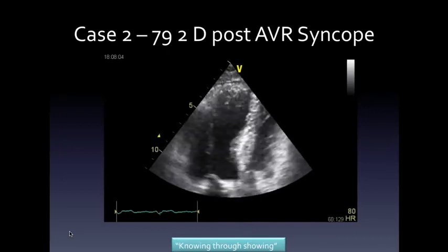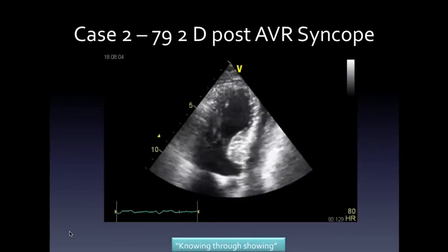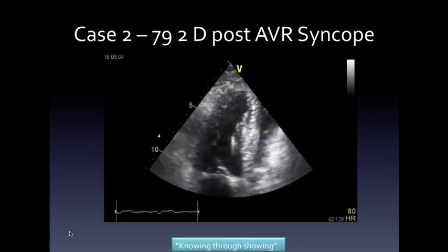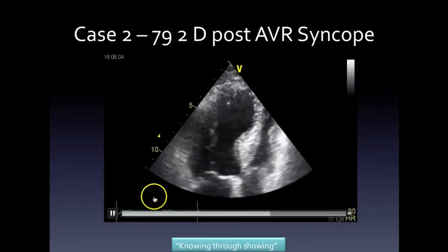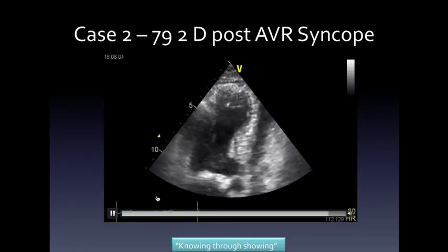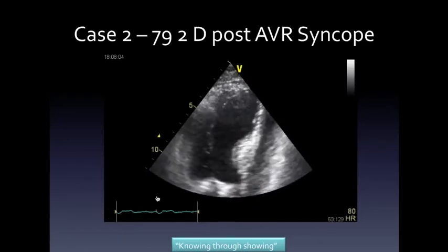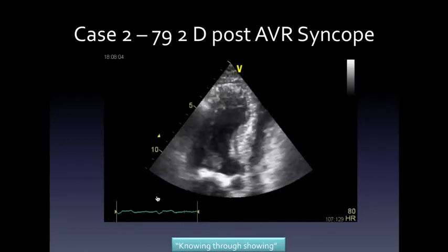Okay, well you're saying nothing because you've only one view, that's a fair point. But it doesn't look like the worst part of it. Do you want to ask me, is this done after an arrest situation, in inverted commas? So is he on an inotrope? We don't know, it's not stated. He's not actually. Is there anything odd about how the heart is moving?